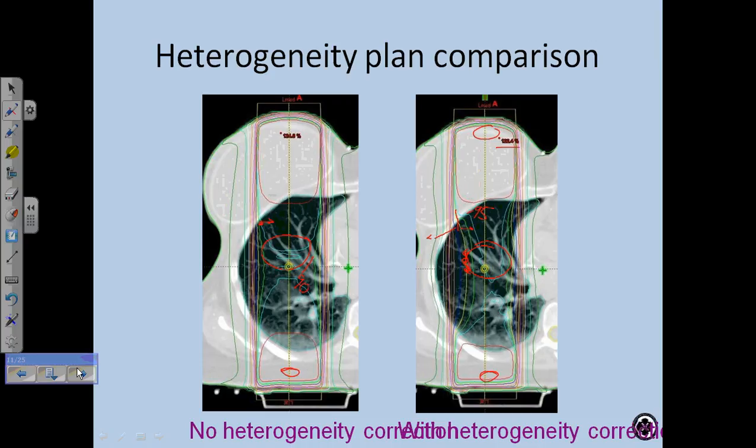The accuracy goes, of the main ones that we use out there, I'll even go back one step. Clarkson, have you heard of Clarkson? Yes, the book. Clarkson integration, that's the least accurate. Then there's pencil beam. Then there's convolution, and then there's AAA. And then there's superposition. These are in increasing accuracy. Oh, and then there's Monte Carlo. I'll talk about these a little bit more later on another slide. So this is increasing from least to most.